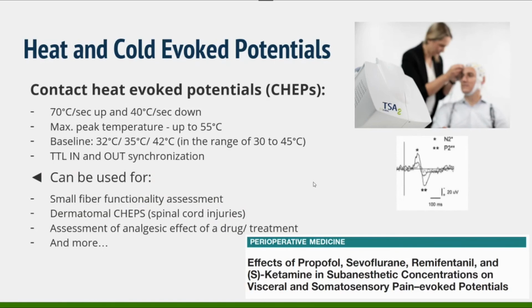these drugs that were used here influence the CHEPS amplitude, and not only the drug itself, but the higher dose resulted in lower amplitude. So again, really a very nice paper and very nice potential application. And there are more. I just reviewed the main applications we know about, but there are more. There are many uses of the CHEPS technique, and it can be done with our new CHEPS for TSA2 device accessory.